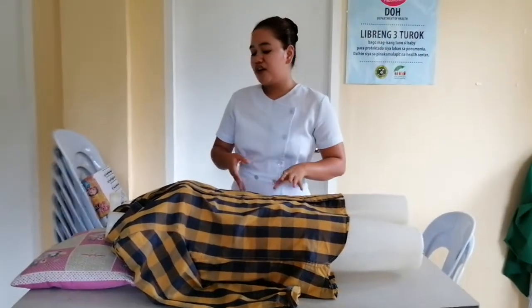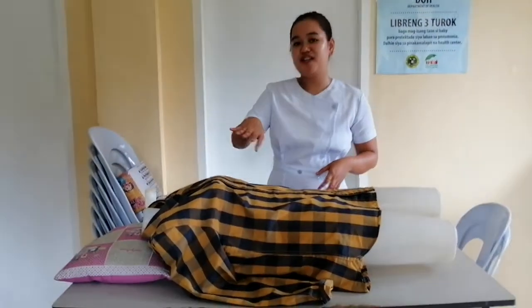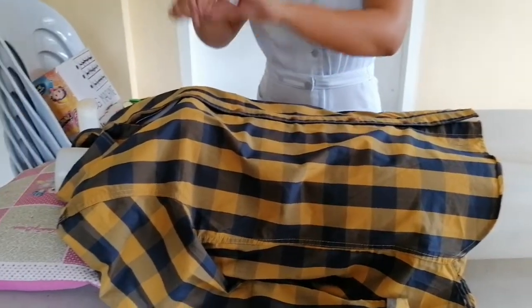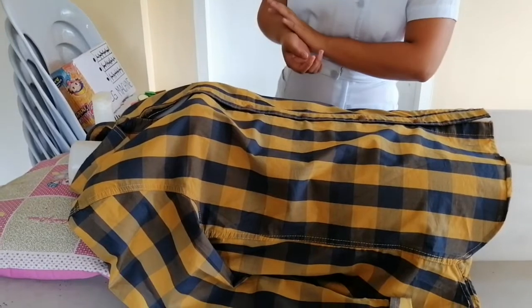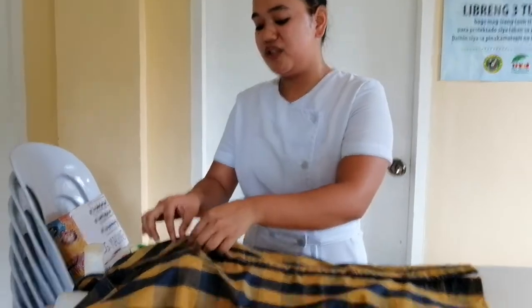And then, you are now going to assess the client's chest. But before you proceed, ask the client if he or she wants you to open or expose the chest. This is to provide privacy to the client. So ask the patient first, "Ma'am, pwede ko po bang expose yung damit nyo, buksan yung butones?" If the client responds yes, you may continue the procedure.